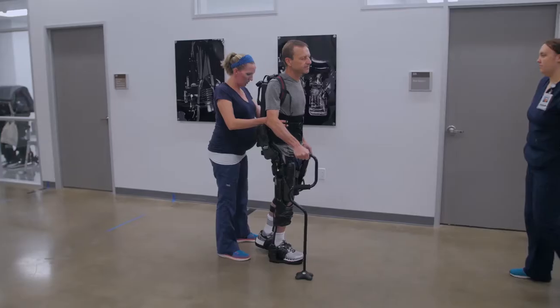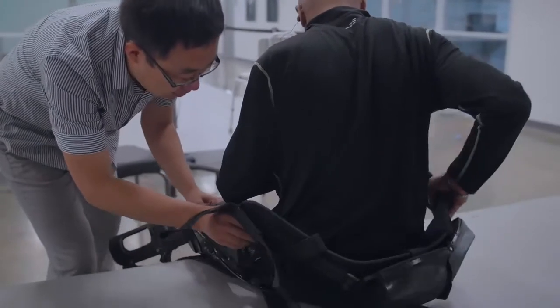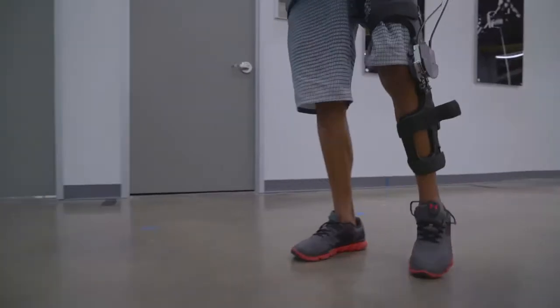Many of the robots that we have right now are not practical to be used at home, so we are trying to design a robot that can be put on and taken off easily because it will be lightweight and easy to manipulate. It's something that I predict will be very useful at home for many of our patients.